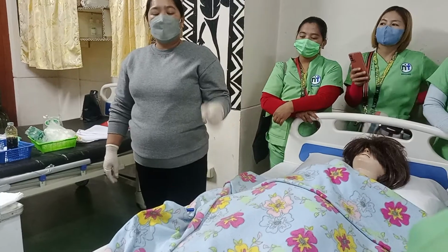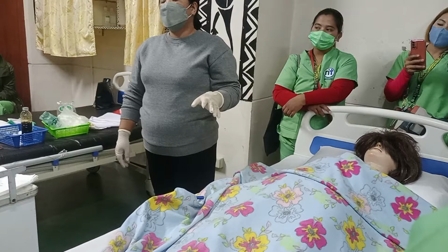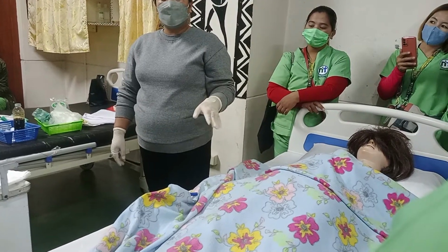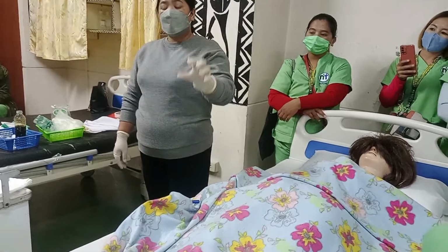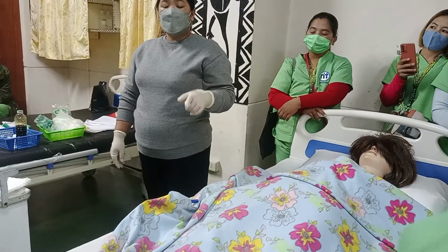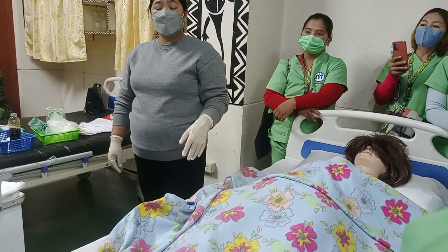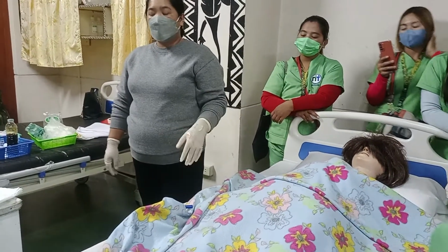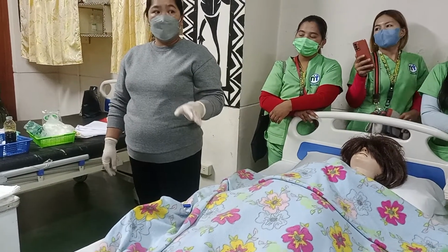Okay? So usually, ang pagtanggal ng urinary catheter, in-order yan at least 24 to 72 hours bago yung remove the catheter. So, sasabihin doon, train bladder. Okay? Close open the bladder every 3 hours, 1 hour in between, sabi niya. So, every 3 hours kang maglalak ng 1 oras for the next 24 hours.